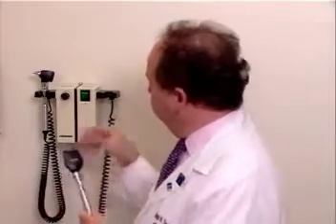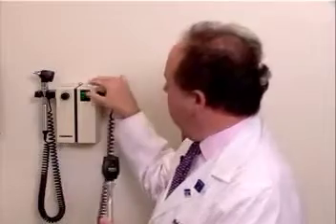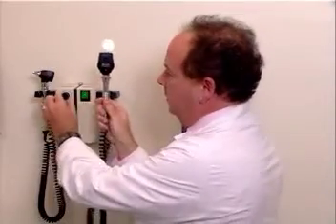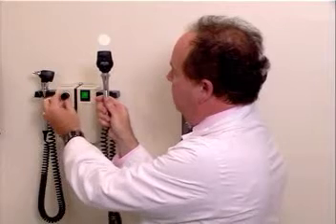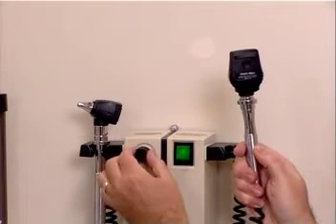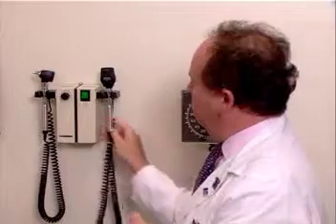Thank you. This is the wall-mounted ophthalmoscope, and its operation is quite identical to the handheld unit. The only difference is that instead of the control on the handheld unit here, one has the on switch here. And the control of the intensity of the light is by this knob right here. In the newer wall-mounted unit, the brightness control is in fact in the handle. When one places it back into the holder, the instrument is turned off.